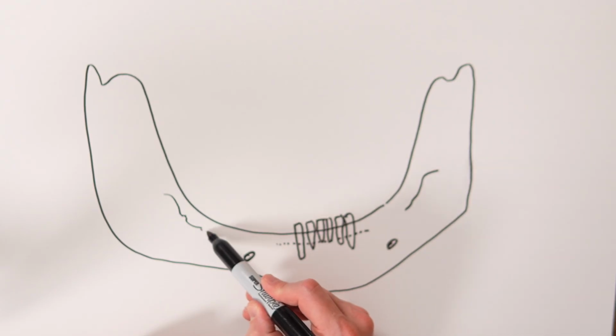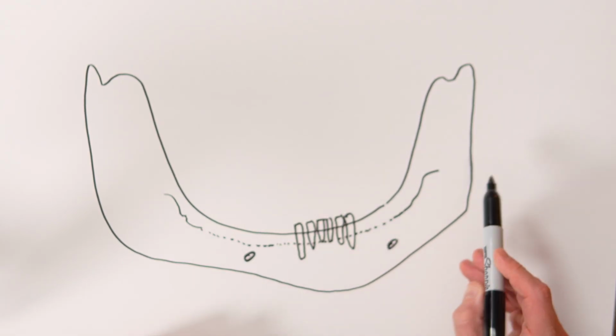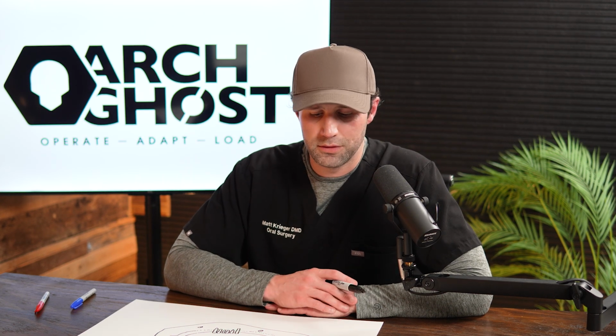The benefit to that is that if you draw a magical line that kind of follows that around, what you'll see is that, again, almost always, never say always, but almost always, it will very closely mimic a 15-ish millimeter reduction. And this is a great way to quickly reference or visualize your reduction.